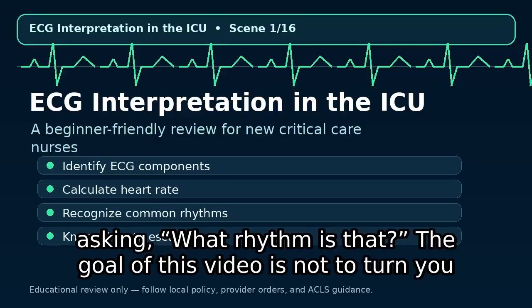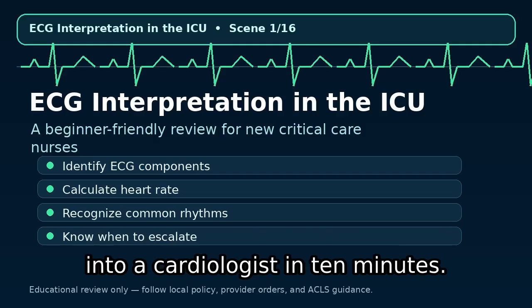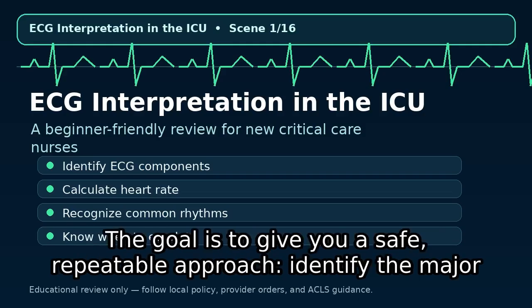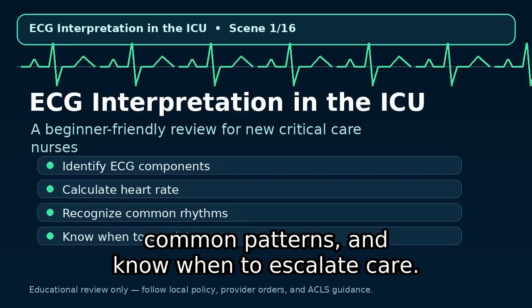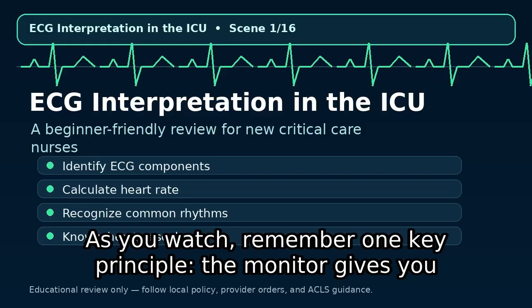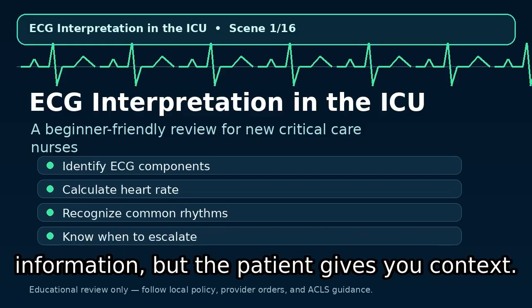The goal of this video is not to turn you into a cardiologist in 10 minutes. The goal is to give you a safe, repeatable approach, identify the major parts of the ECG, estimate the heart rate, assess the rhythm, recognize common patterns, and know when to escalate care. As you watch, remember one key principle. The monitor gives you information, but the patient gives you context.